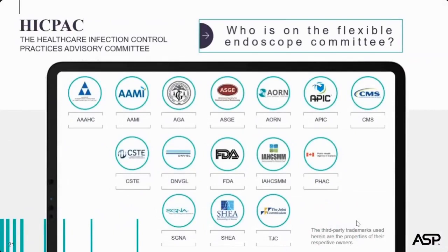So who makes the decision on how we process flexible scopes? HICPAC is a federal advisory committee who provides guidance to the CDC and the Secretary of Health and Human Services. The committee's focus is on practice and strategies for surveillance, prevention, and control of healthcare-associated infections, known as HAIs, antibiotic resistance, and related events in the United States. The organizations and agencies listed here were tasked in 2015 to provide guidance on ways to improve facility-level training in ensuring competency for reprocessing endoscopes. And we see there's a good representation from infection control to professional organizations such as AORN, AAMI, the FDA, and also the Joint Commission. In addition, HICPAC provides a toolkit of sample documents to accompany its guidance.